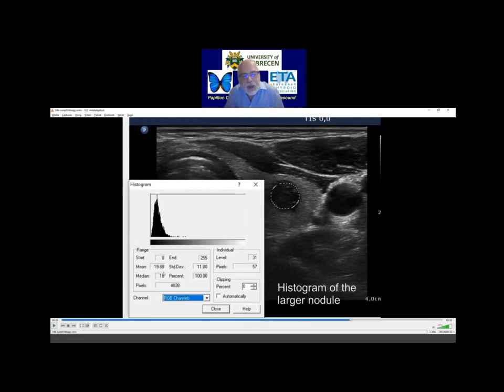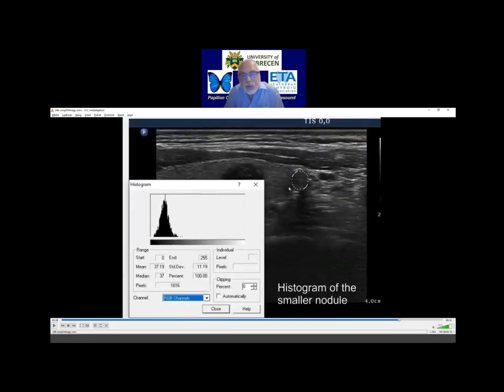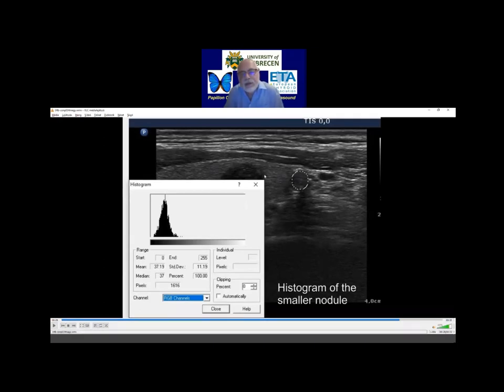This nodule had a value of 20, so this is darker. We proved that this is darker than the strap muscle running ventral, so this should be regarded as a deeply or very hypoechoic nodule. In contrast, the smaller lesion, which proved to be papillary cancer, has a value of 37. The muscle had 30, so this is lighter than the strap muscle and should be regarded as a minimally to moderately hypoechoic nodule.